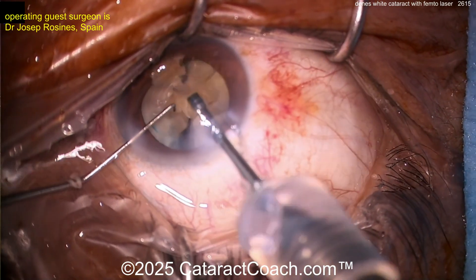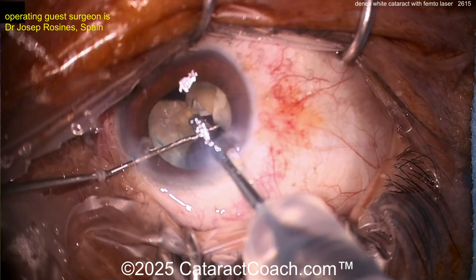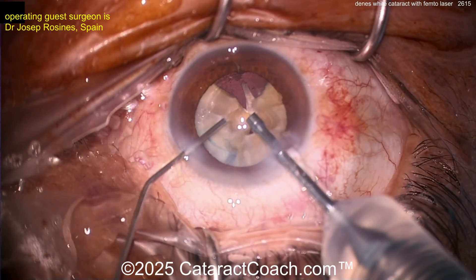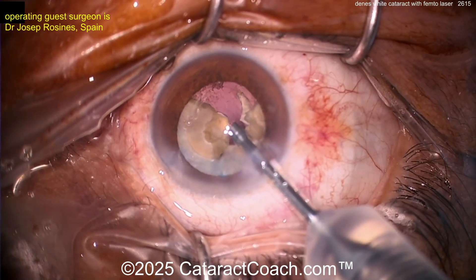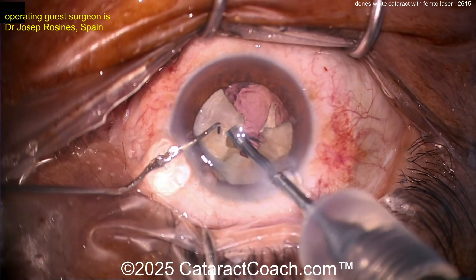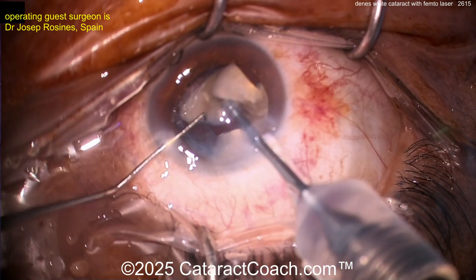One reason I like to sit temporal when I operate is that I have a lot more access. It can be tough when you sit superior if a patient has a big brow — like in this case, kind of hard to keep the eye in primary position. More viscoelastic to protect the endothelium and the capsular bag — that's a smart move. Now let's finish chopping up this nucleus. Femtosecond lasers can certainly be useful for certain types of tough cases.